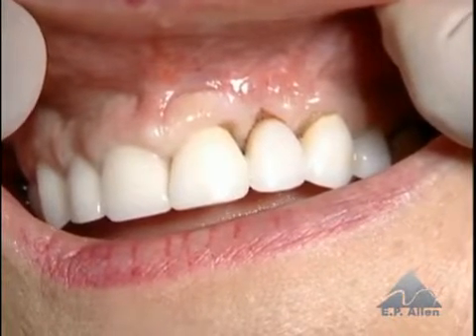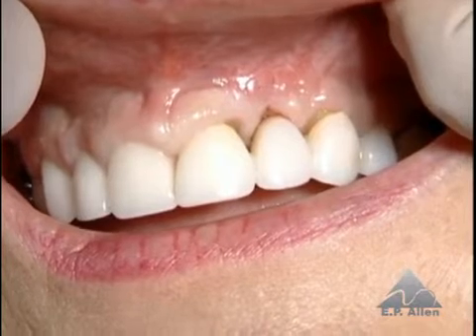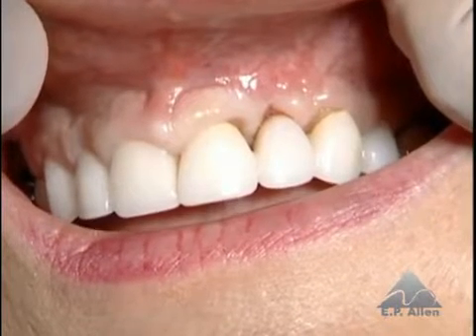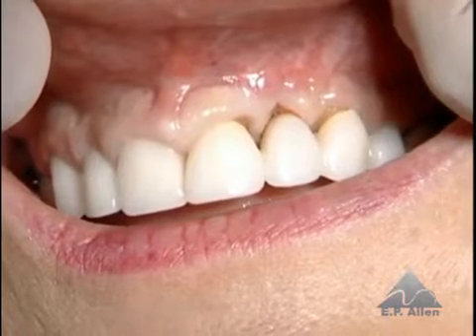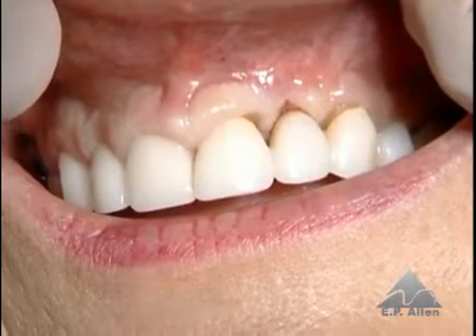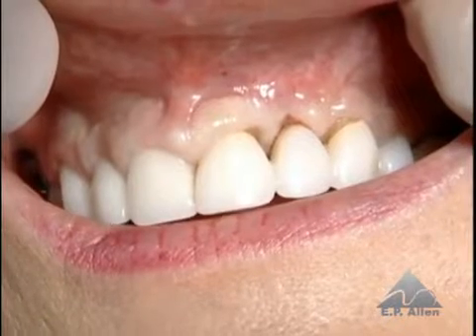The procedure that we're going to do today is a ridge augmentation to treat the area where there's a missing tooth in the lateral incisor area with loss of papillary height and some vertical dimension problem. There is a little bit of buccal dimension problem, but not much, because we have previously performed a ridge augmentation procedure, soft tissue procedure, to correct the buccal deficiency and some of the vertical.